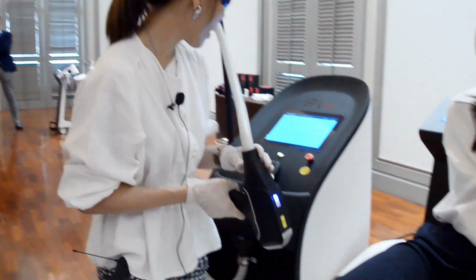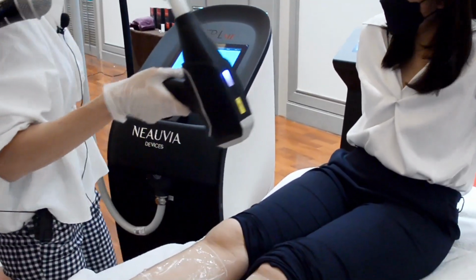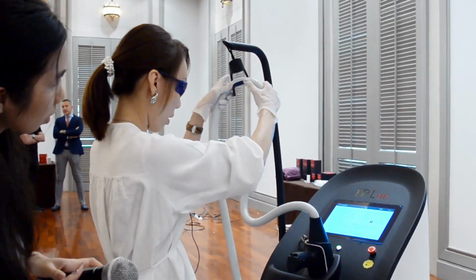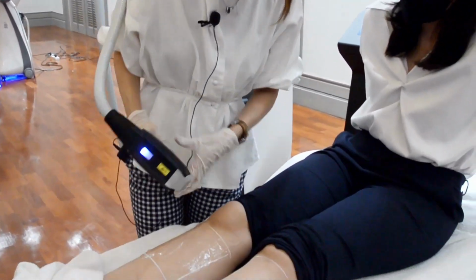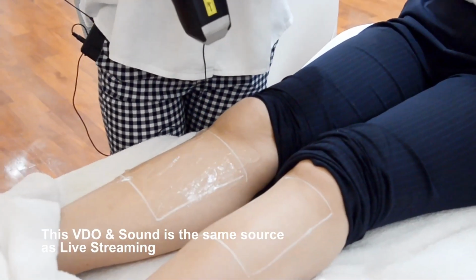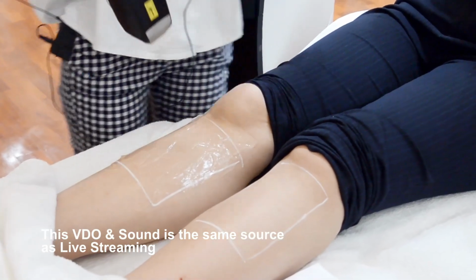Okay? So we can see that the device is ready. Just hold on, let me bring it down a bit more. So if you want more stability, I would highly recommend that you use both hands to hold the device, the handpiece, rather than just one.